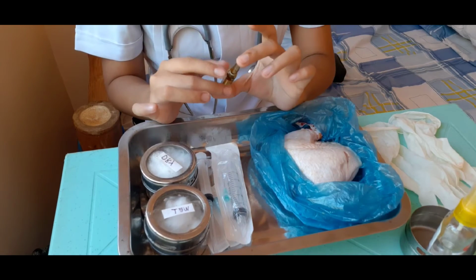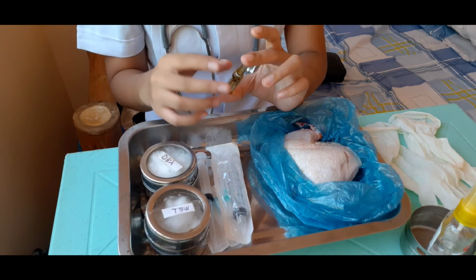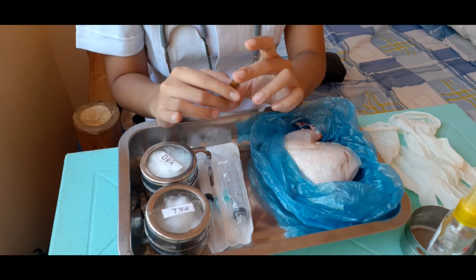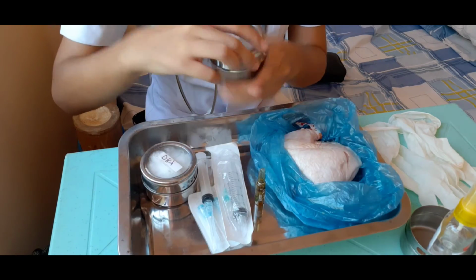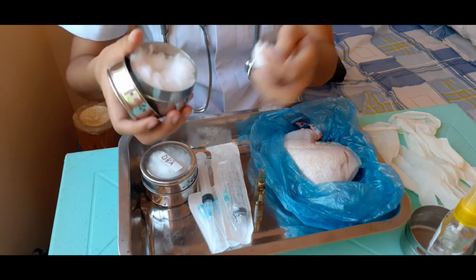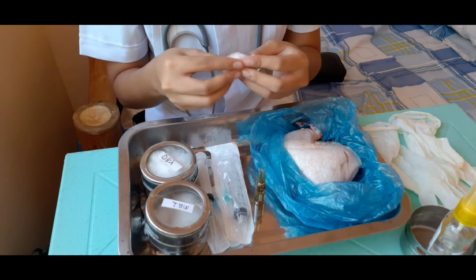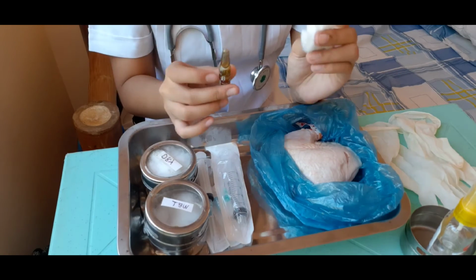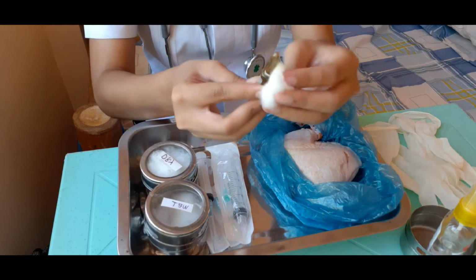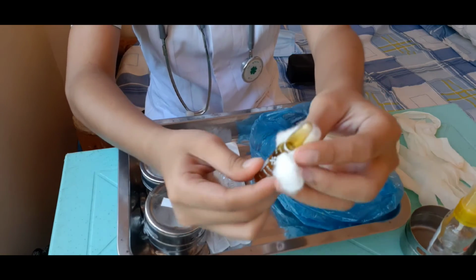So next is that by flicking the upper stem of the ampules, we need to use the ampule opener or some piece of sterile gauze. We don't have sterile gauze, so I have here some cotton to place as an alternative to sterile gauze. And before that, we clean the neck. Just like that, we just clean the neck.